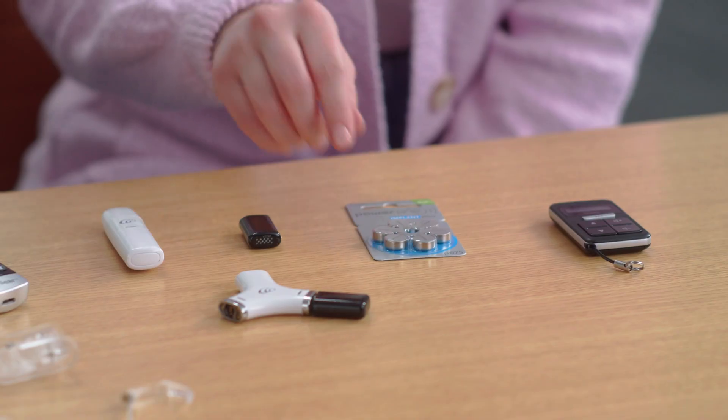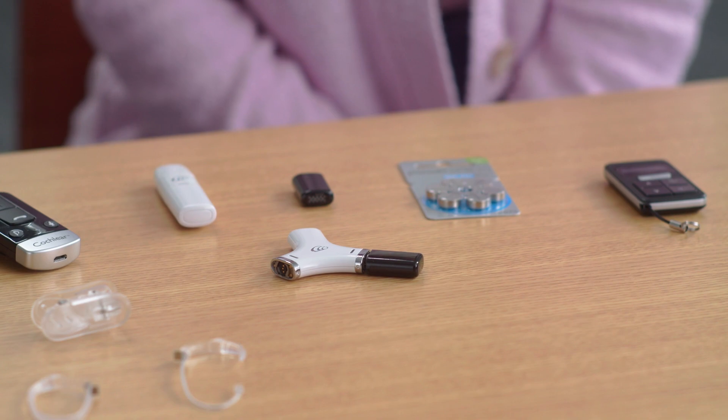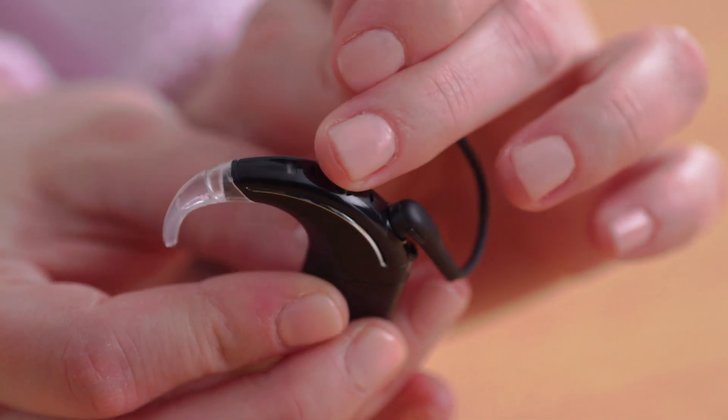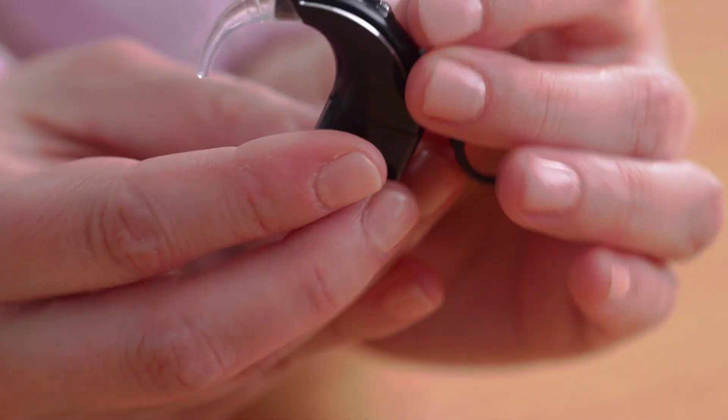Your kit comes with disposable batteries as well as rechargeable batteries. For now, we'll use a rechargeable battery. To turn the Nucleus 8 on, simply attach the battery or press the button one time. To turn it off, you can also remove the battery or hold the button until the light turns a steady orange.